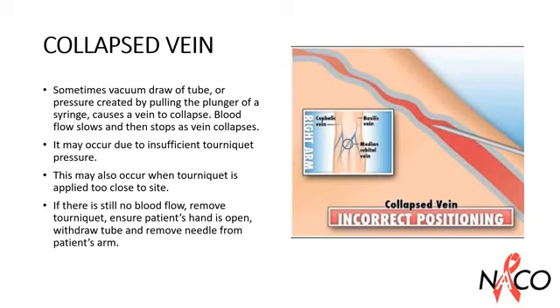If still no blood flow, remove the tourniquet. Ensure again that the patient's hand is open. Withdraw the tube and withdraw the needle.